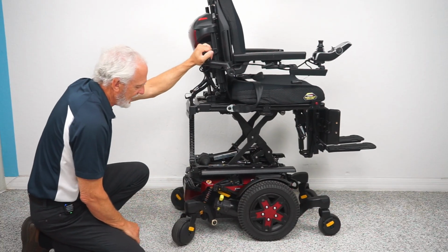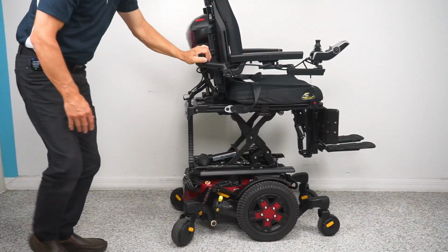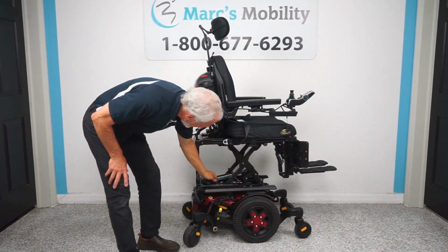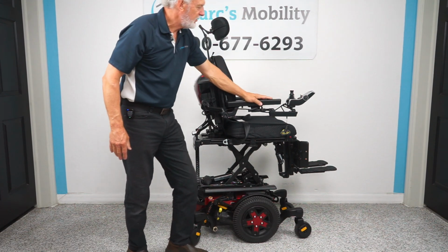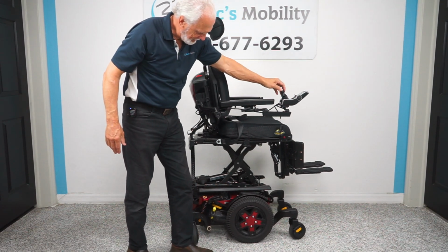Now you can see you're back in gear. You can see the suspension on the motor from the front wheel, the springs. You can see the armature for the seat lift. The actuator is actually right here. Just a really nice power chair. So we're going to turn it on, give it about 3 seconds, and we're back in business.